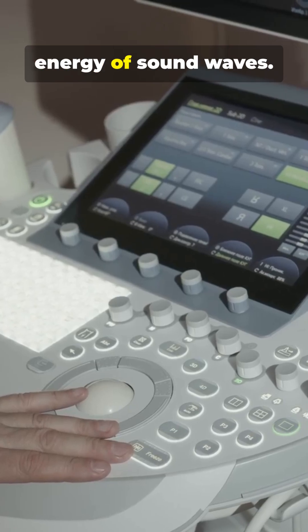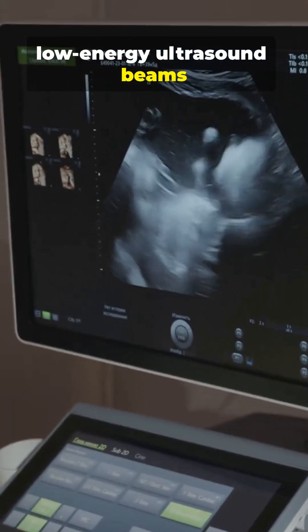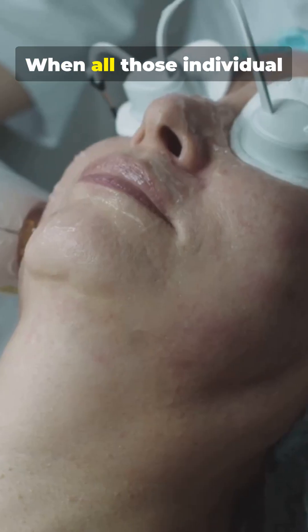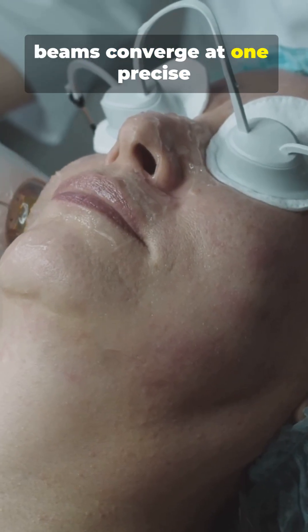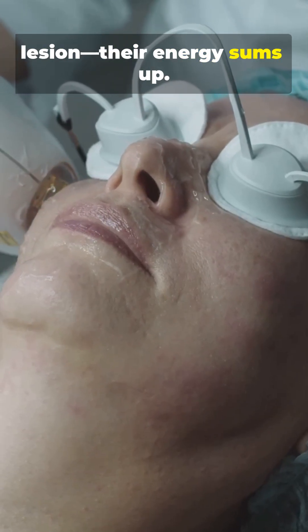FUS works by harnessing the energy of sound waves. The machine aims multiple low-energy ultrasound beams at the target area from different angles outside the body. When all those individual beams converge at one precise point — the target tumor or lesion — their energy sums up.